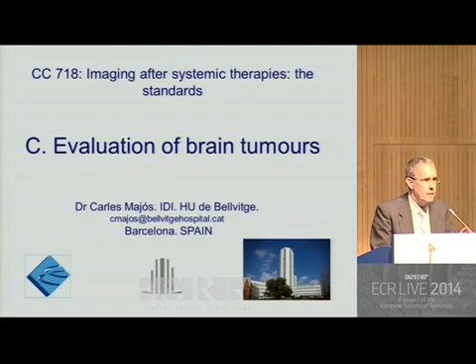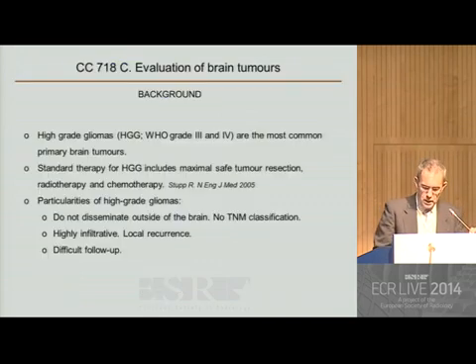Good afternoon, ladies and gentlemen. In this presentation, we will focus on the imaging after systemic therapies in the evaluation of brain tumors. In particular, we will focus on the evaluation of high-grade gliomas, because high-grade gliomas are the most common primary tumors in the brain.